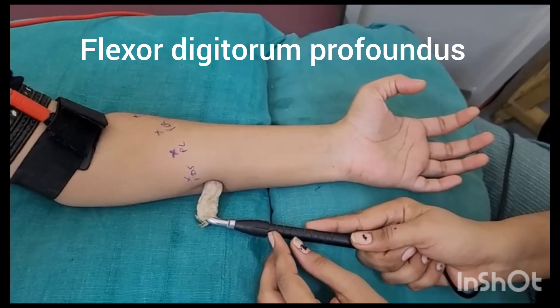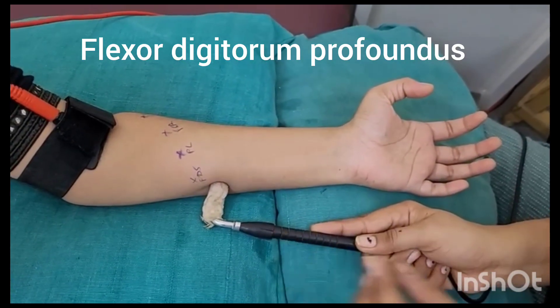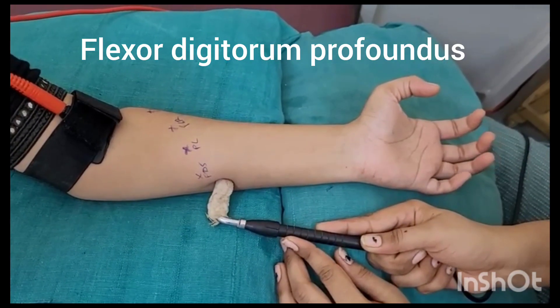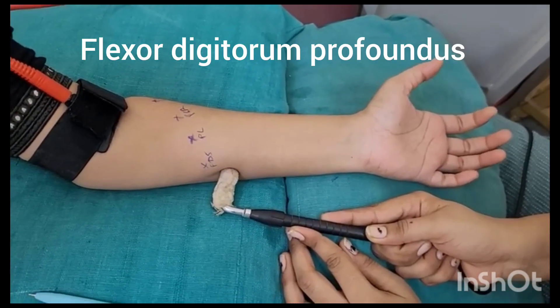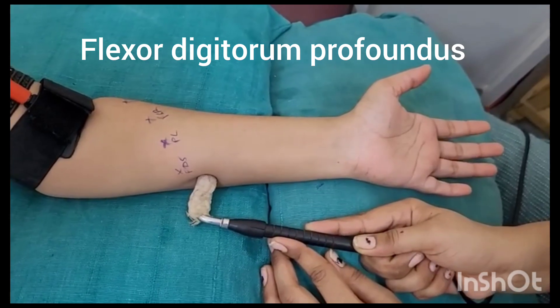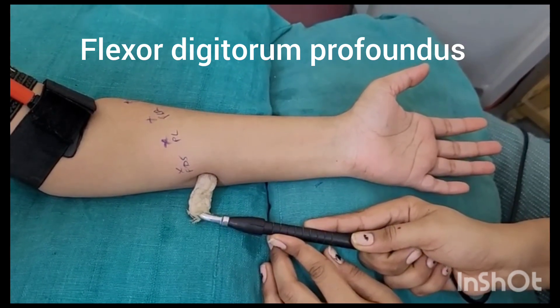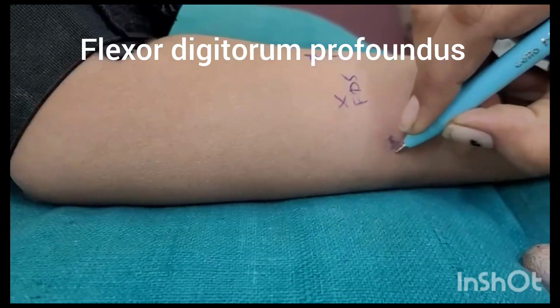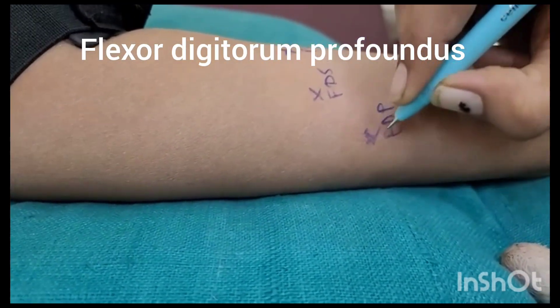Flexor Digitorum Profundus. Muscle action selection. Flexor Digitorum Profundus.